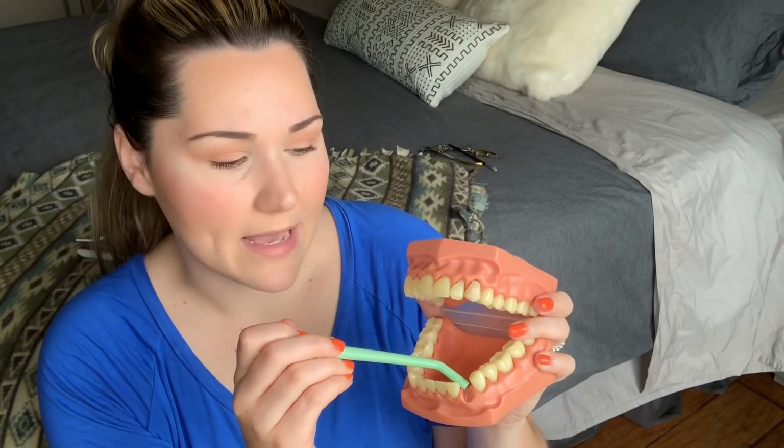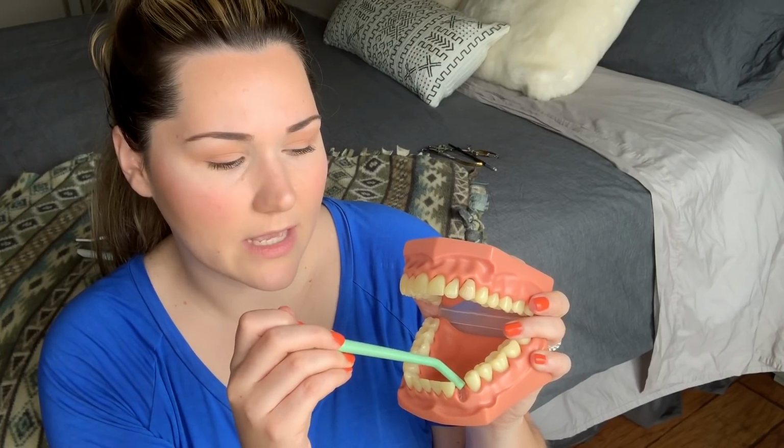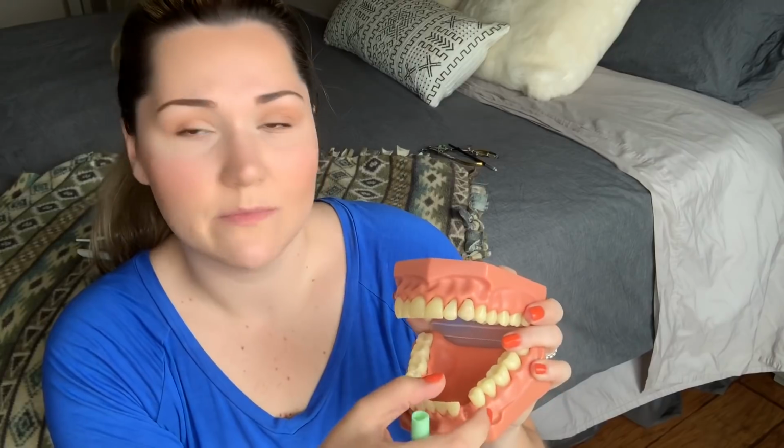And you don't leave your surgical suction in the mouth at all times, okay? I leave it outside the mouth while he's doing the extraction. And then as blood forms or comes out, I will bring it in and just kind of tap around the gum in the tooth area. And then once he removes the tooth, I will wait for him to grab irrigation. Actually, this has an opening down here. This would be easier. So say the tooth's out, he's irrigating. I'll bring my irrigation in, usually from the back like this, and then he'll irrigate it and I'll just suck out like that. And then of course you grab cotton and you put it there and have the patient bite down. So surgical suction is a little bit different because it's not in there at all times.